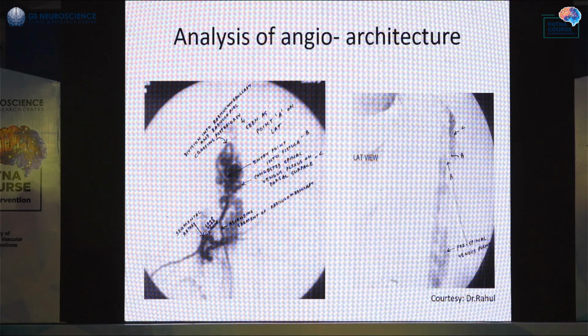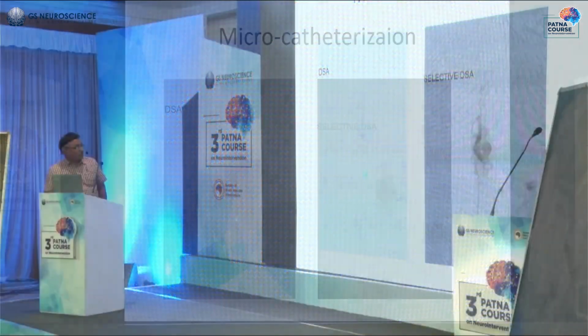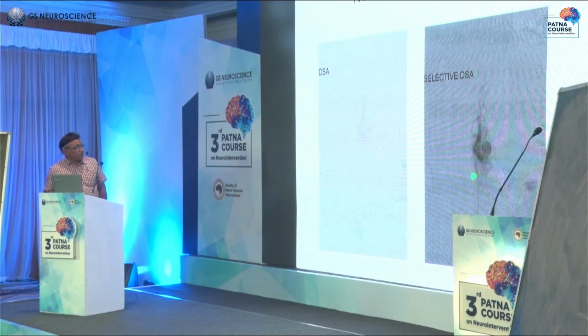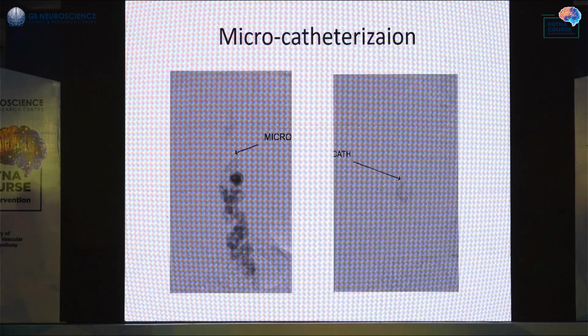This is the lateral view. This is the microcatheterization with the Magic catheter. The first microcatheter is up to this proximal segment, and then we went to more depth.